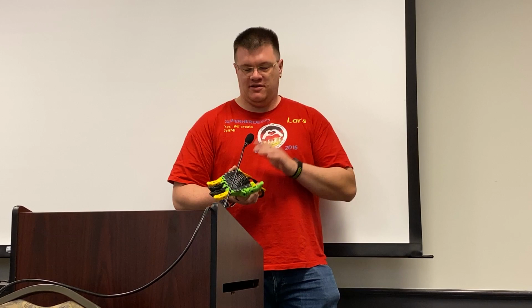And for me, it is like this. If you do two gauntlets, they look totally different, and that is what bothers me. If I want to create something, it should always look the same. So I started thinking about that, how much do you need to really accomplish a similar design, and just do it one time and then you print it another time.